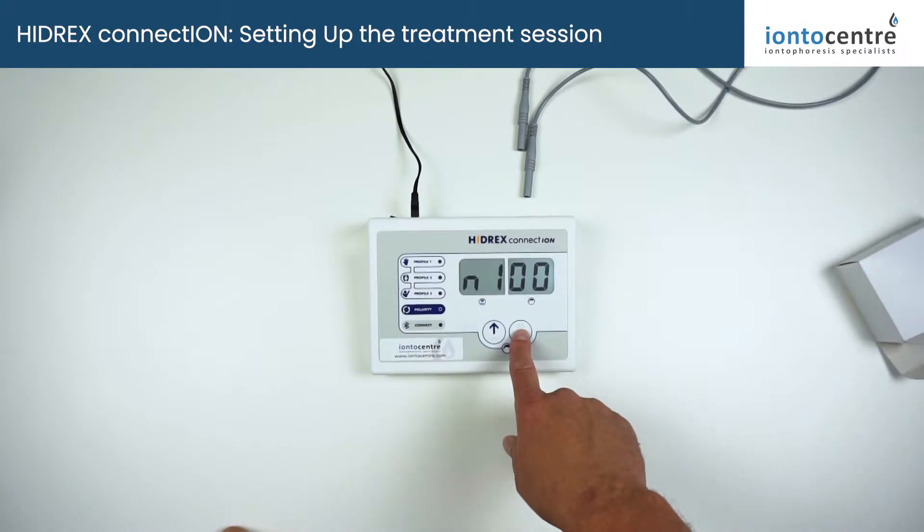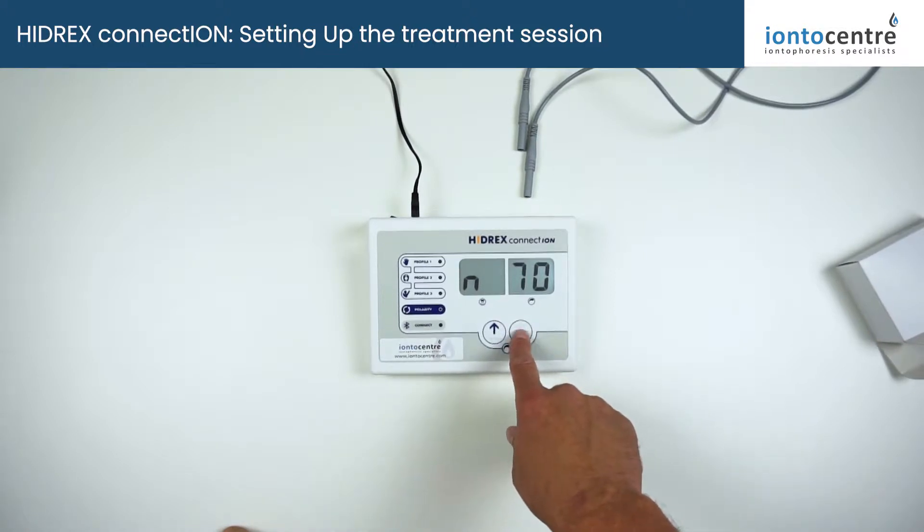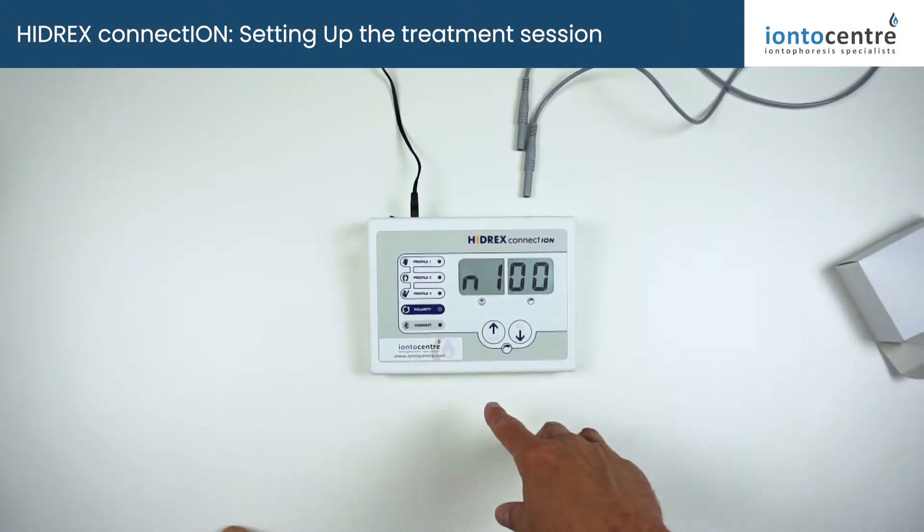Generally for the feet, we recommend direct current at 100%. For underarms and sensitive areas, start with P90, and if it's uncomfortable you can always reduce down to P50, which is the mildest form of pulse current. Make your selection — leave the screen for a few seconds and it will automatically go to treatment mode.